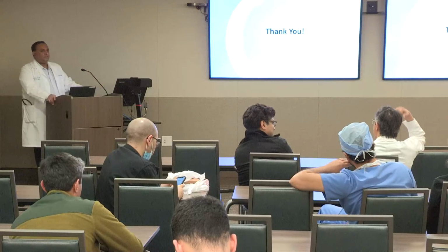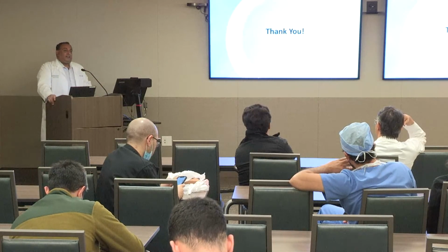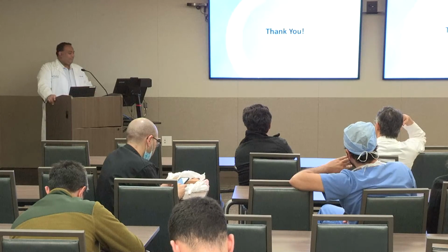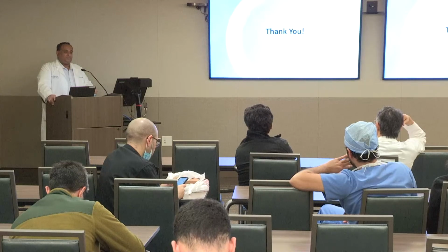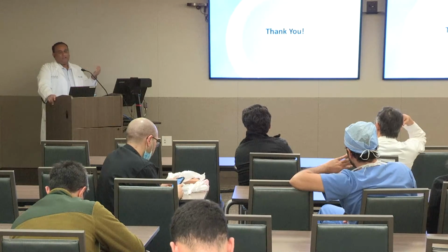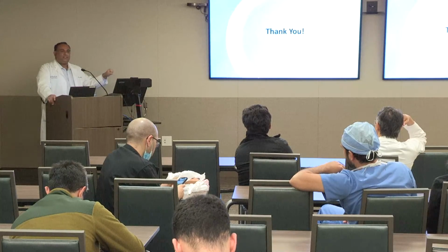So Dr. Ahmed, do you think we should be reporting in CAD-RADS format? It's a good document. Some of it, the degree of stenosis, yes, everybody needs to report it. And yes, the plaques, we say mild, moderate, severe, right? But beyond that, to plug in all those management decisions and what should be the further testing, the clinicians know that.